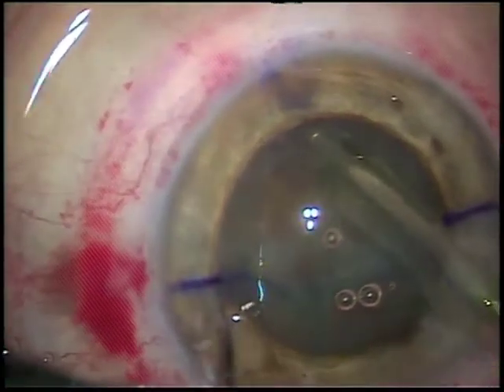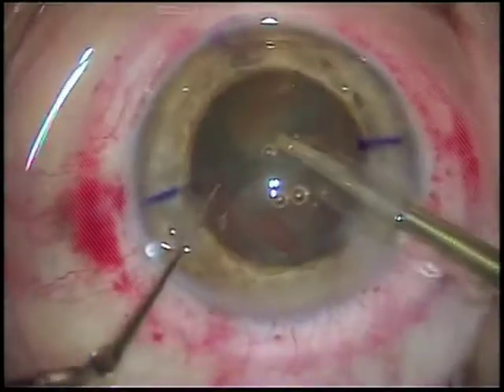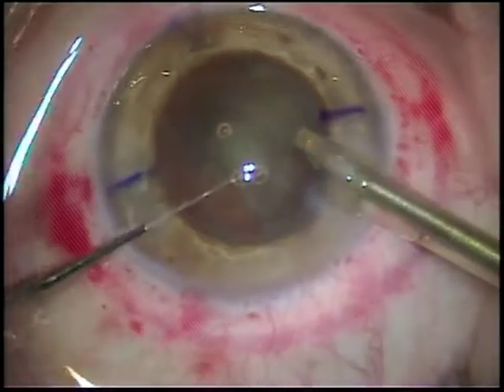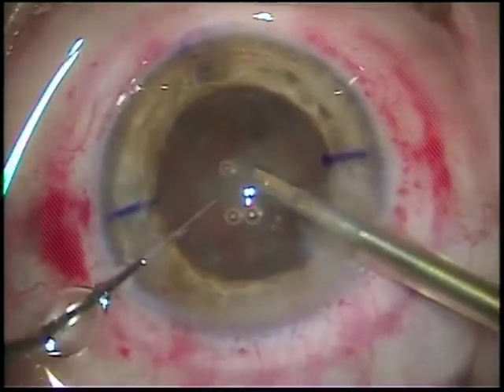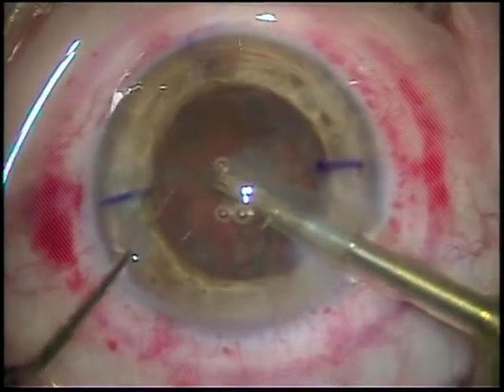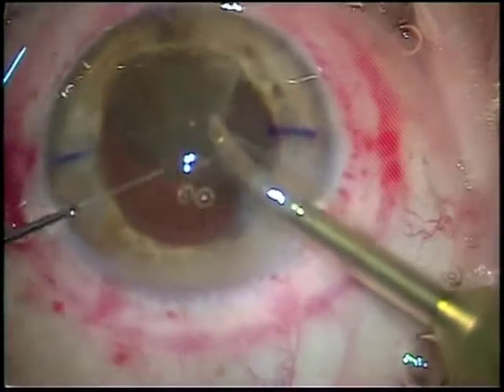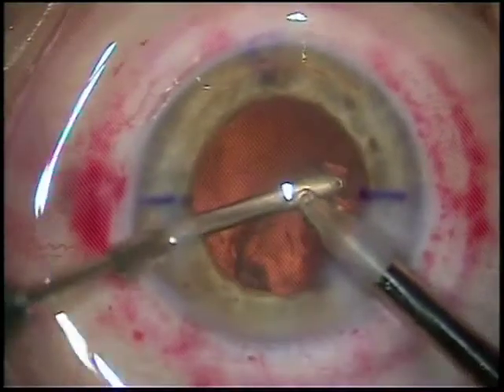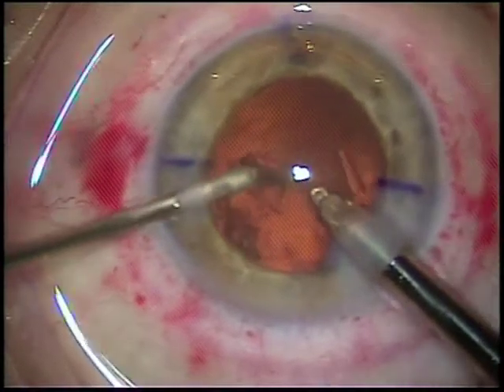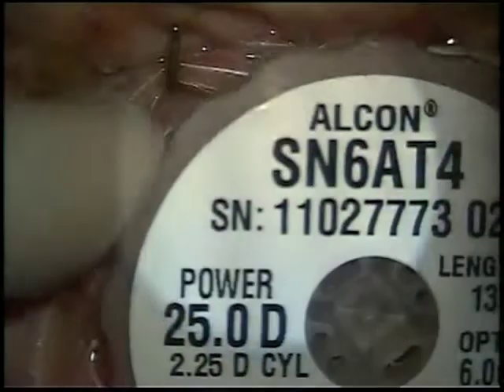In the eye with the phaco tip, and you can see how easy it is to break and dissect the pieces of the cataract that have been pre-chopped with the femtosecond laser. We're down to the last two pieces, and you can appreciate here that this is a real dense cataract. But the ease with which it's removed is remarkable. Very reduced energy on the phaco, and we're finishing here with removing the cortex.